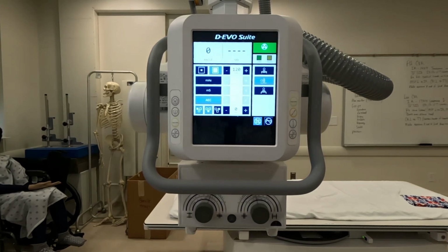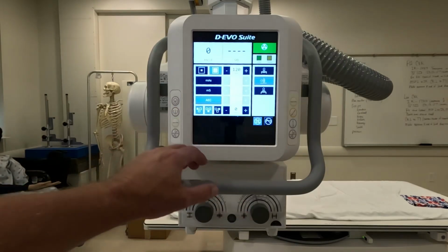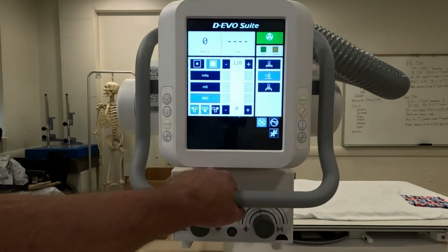Another skill that you need to master pretty quickly whenever you get into clinicals, just to save yourself some time and aggravation and some conflict with the technologists that you're working with, is basic X-ray tube manipulation and control.